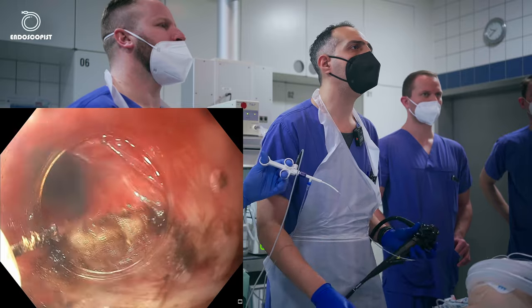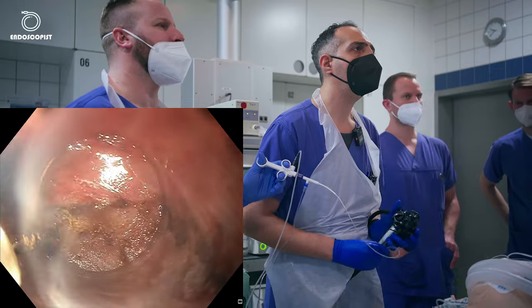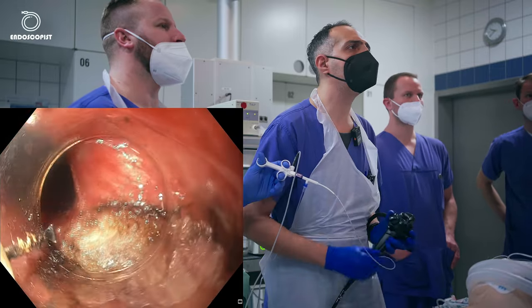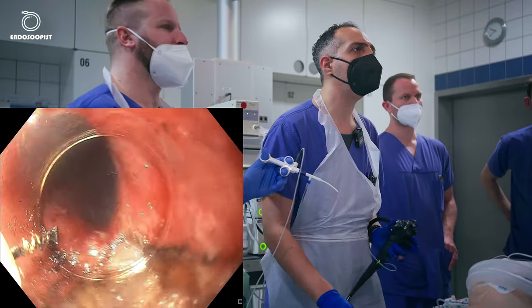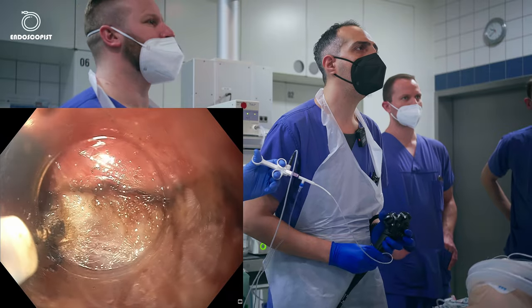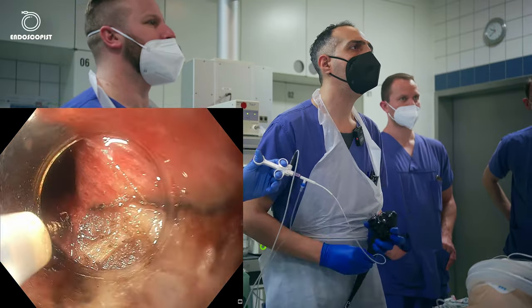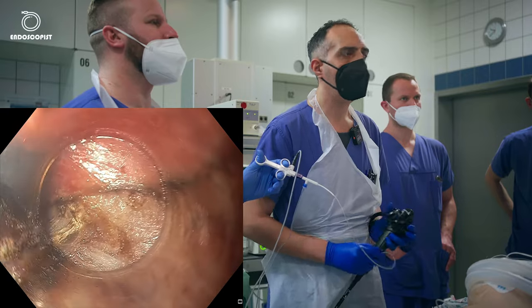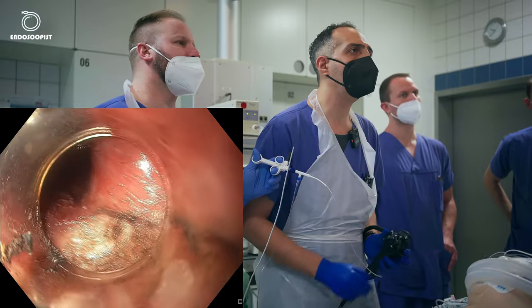Very slowly under vision. If you have a lot of fibrosis or you can't see the layers, make it just layer by layer till you go deep. I will check where I am. So I am by 40 centimeters, so I'm entering the stomach now.